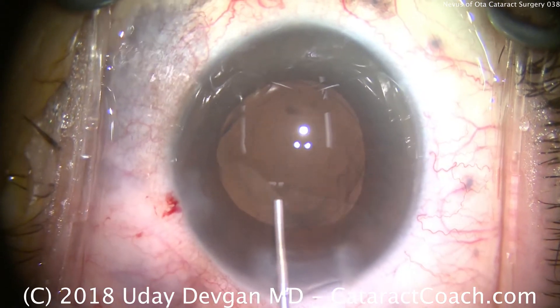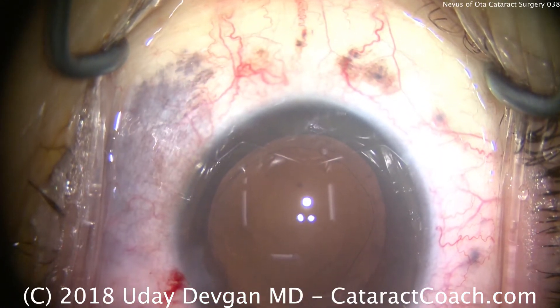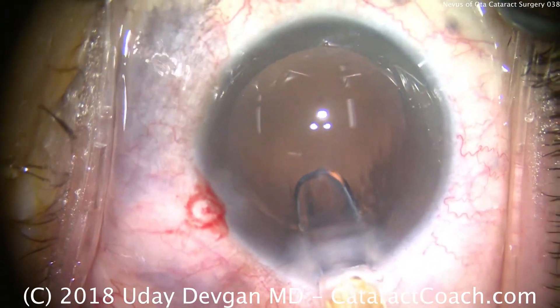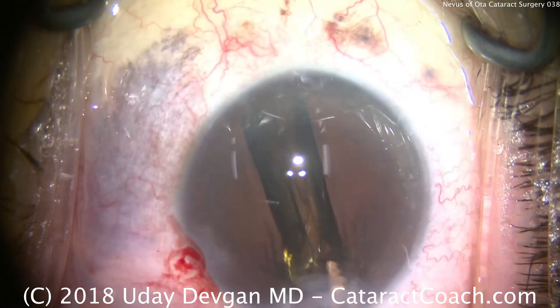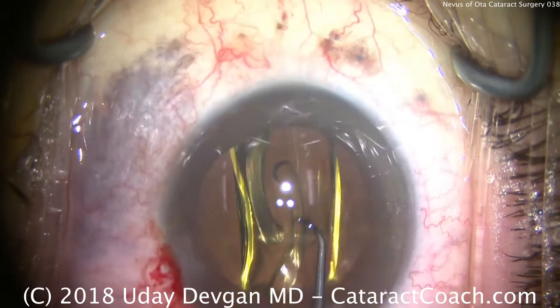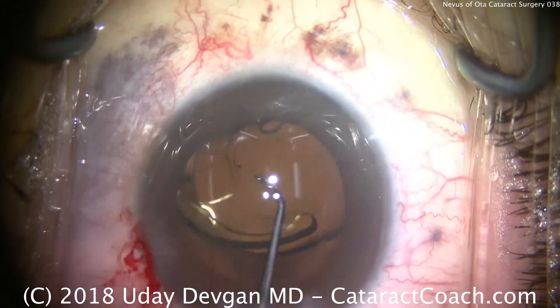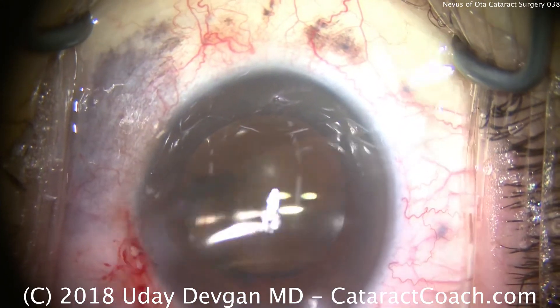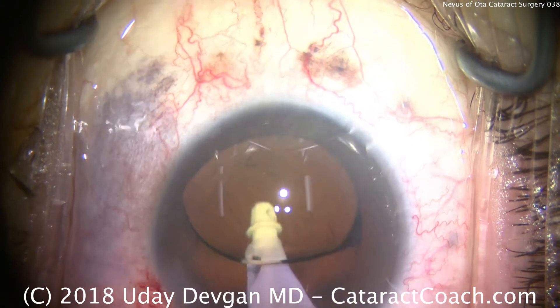We'll now fill the eye with viscoelastic — this time a cohesive viscoelastic. Now we're going to put our lens inside the eye. There's the lens injector; the left hand will fixate the eye for a little counter-traction. The patient wished to remain mildly myopic, to have great functional near vision without glasses, so we chose an appropriate lens power to achieve that. We've opened up the lens; the haptics are now unfolding. Rotate the lens into the 12 o'clock and 6 o'clock position.